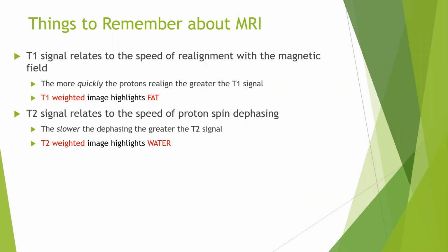That's how you hone the skill of understanding, knowing, and evaluating and coming to a conclusion as to what an MRI is saying. I always tried this initially when I was starting to read an MRI. That is exactly how I started. Whatever I saw, I might be wrong, I might be a little right, it doesn't matter initially. You just write it down on a piece of paper. Then I saw the report of the MRI and compared it with what I had written. Whatever was right, it's good. Whatever was not right, okay, I would better myself the next time. That is how you develop the skill of understanding and reading MRI.